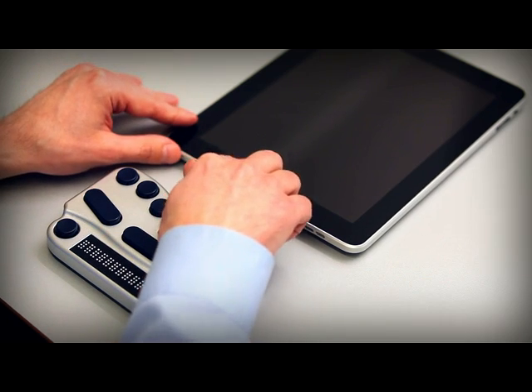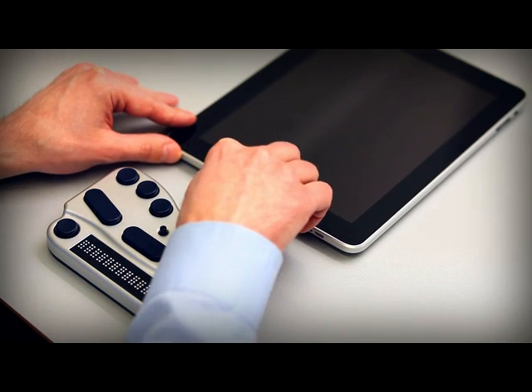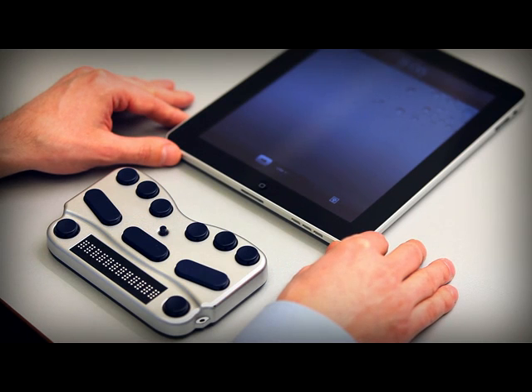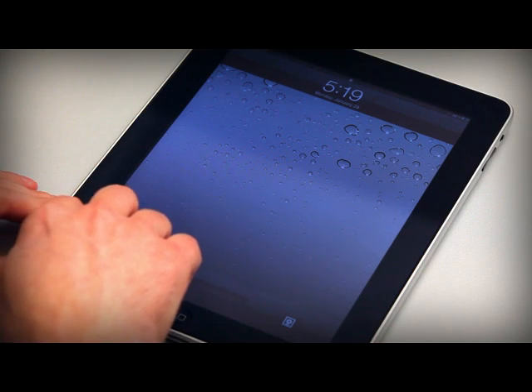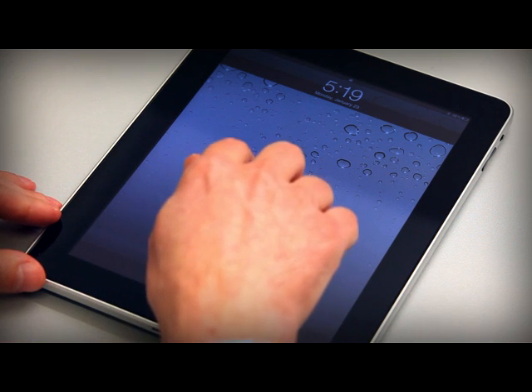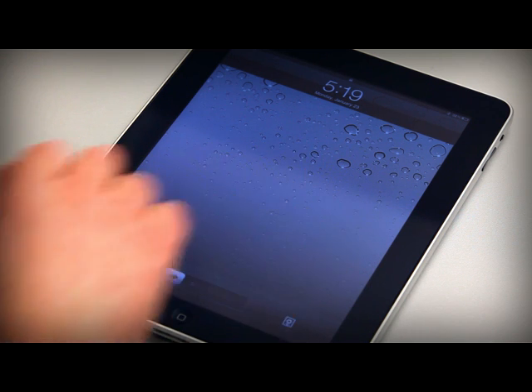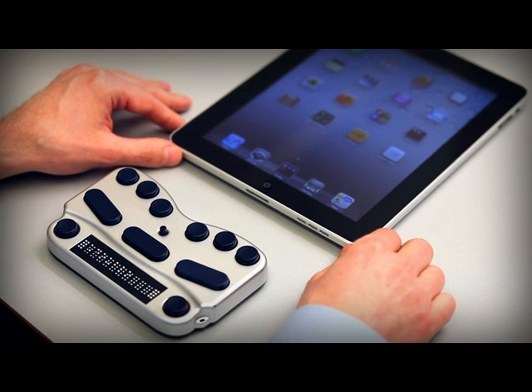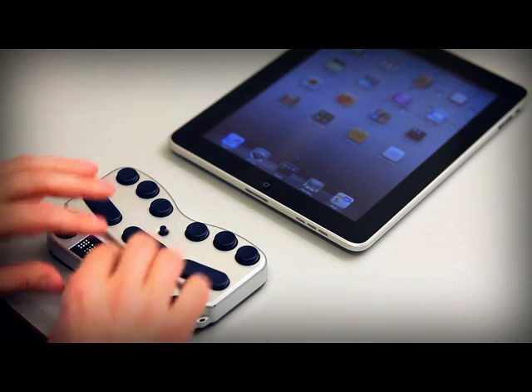If your iDevice is asleep or locked, wake it up or unlock it. Press the home button, swipe your finger across the display until you hear 'slide to unlock' and then double tap. You will hear the Braille Pen 12 beep as it reconnects.